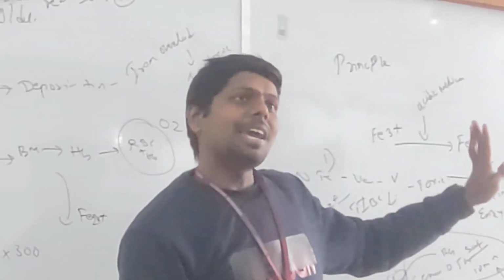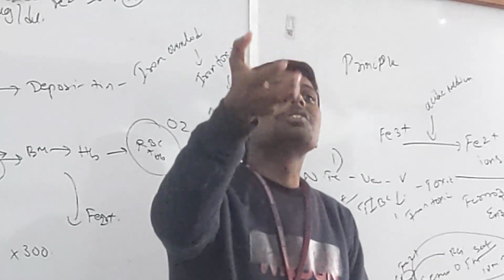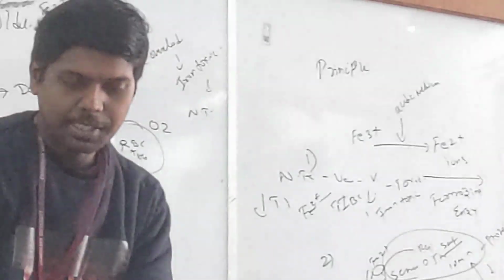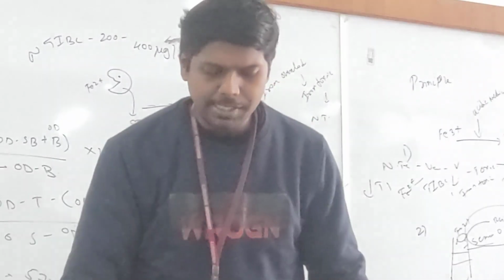TIBC means can a protein bind with excessive iron or not? Total iron binding capacity. So this is all about the total iron binding capacity test. Write down the clinical significance of TIBC.